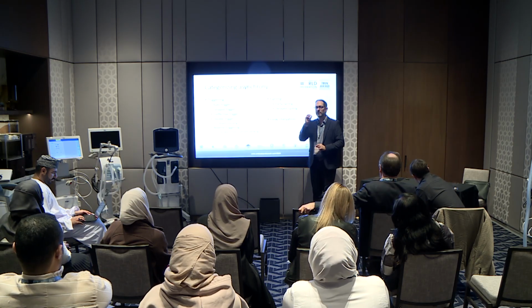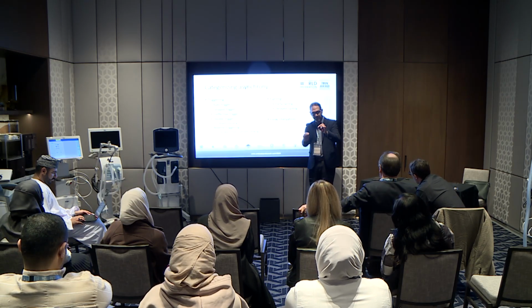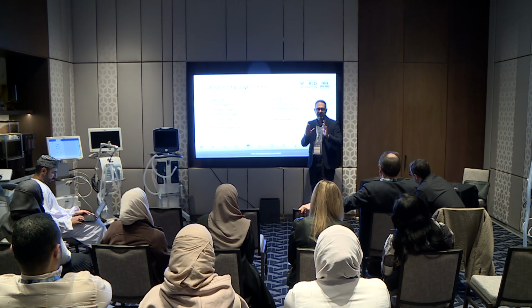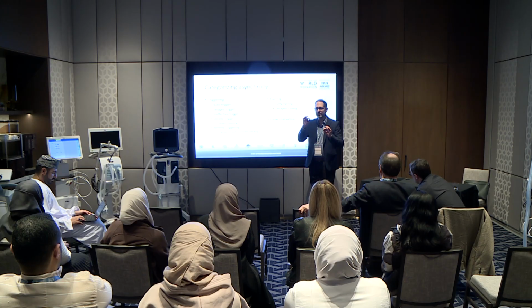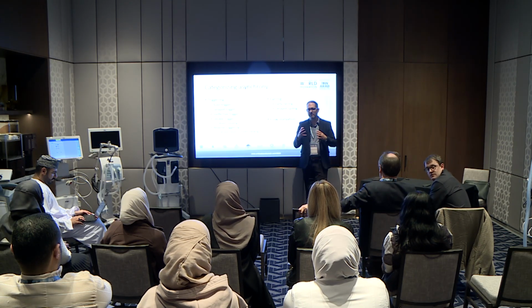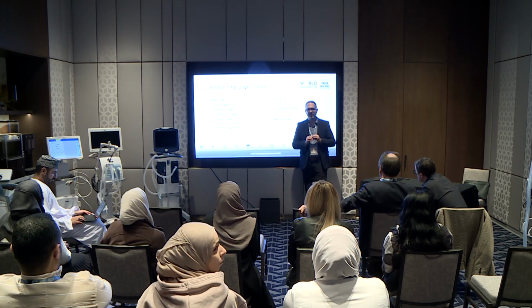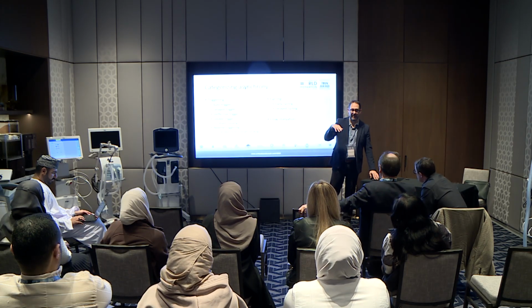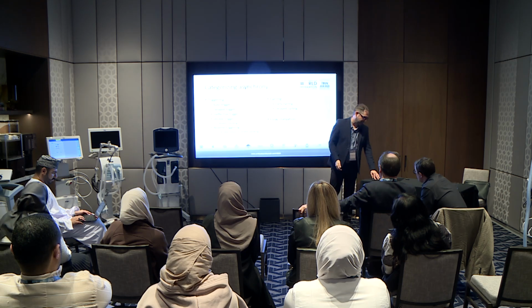Having said that, to the trained eye who has seen all of the tracings before, I'm going to teach you how to look at the pressure and the flow and assume that what you see is asynchrony, and you'll see the patterns. The assumptions I don't think are that crazy. And software has been trained now to identify it without esophageal pressure and EDI as well.